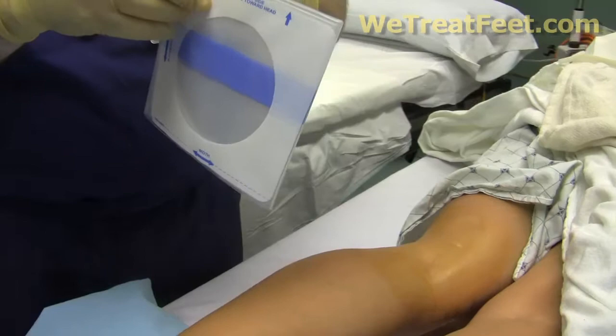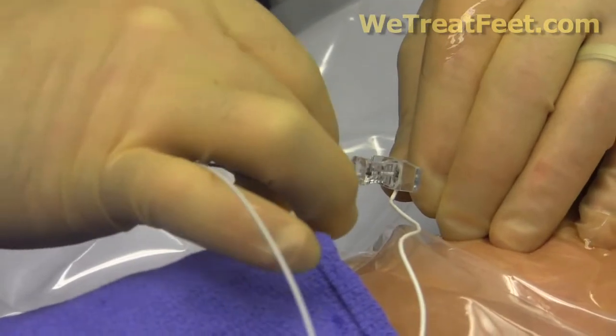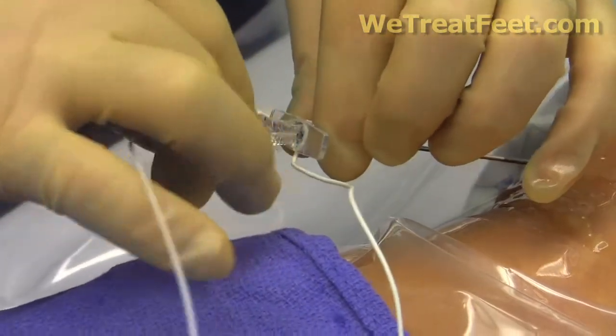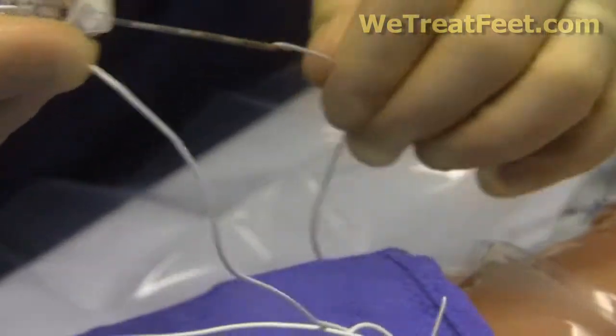Next we put on a drape. This helps give us a bigger sterile field to work with. Keep everything clean. So 5 centimeters past and down into the skin helps to ensure that it's not going to fall out and inject the local anesthetic at the proper spot.